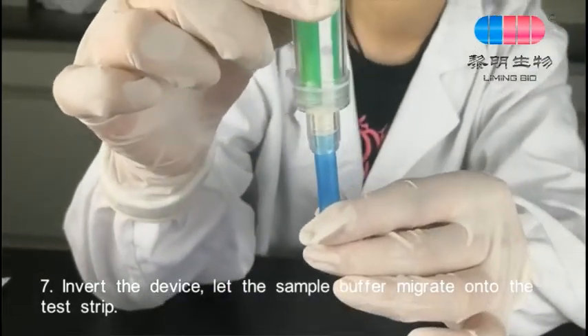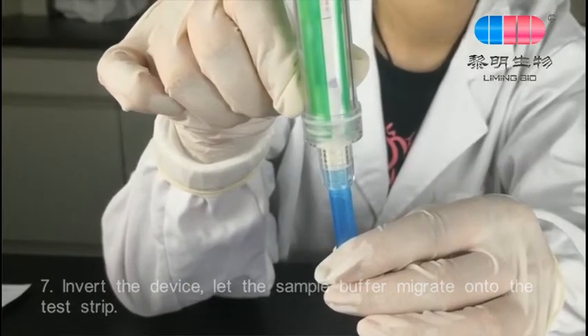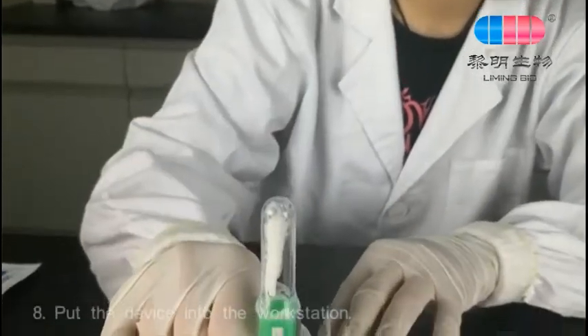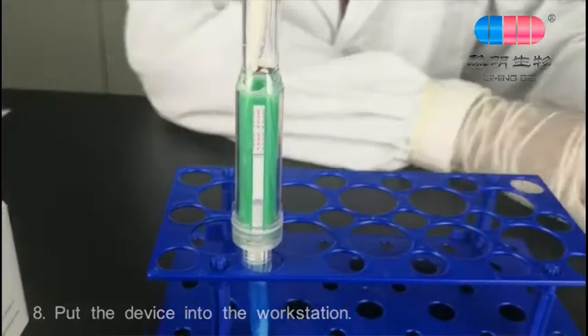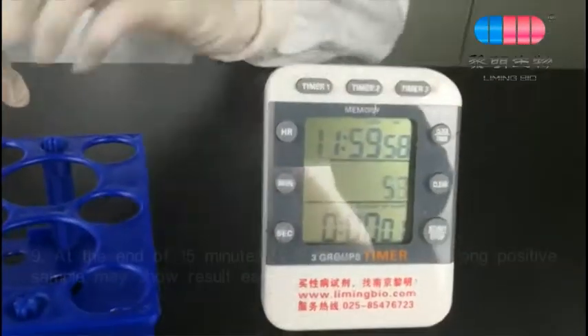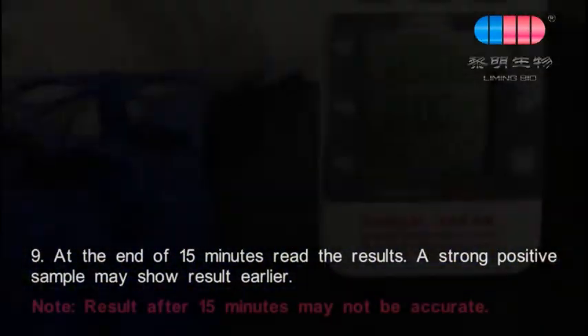Invert the device and let the sample buffer migrate onto the test strip. Put the device into the workstation. At the end of 15 minutes, read the results.